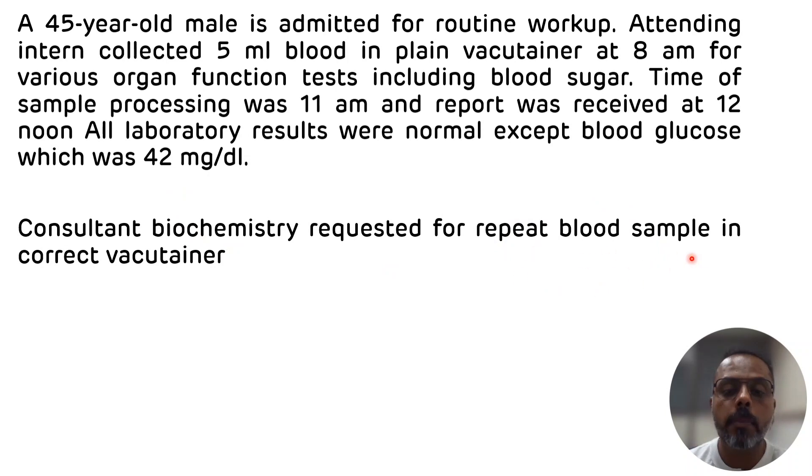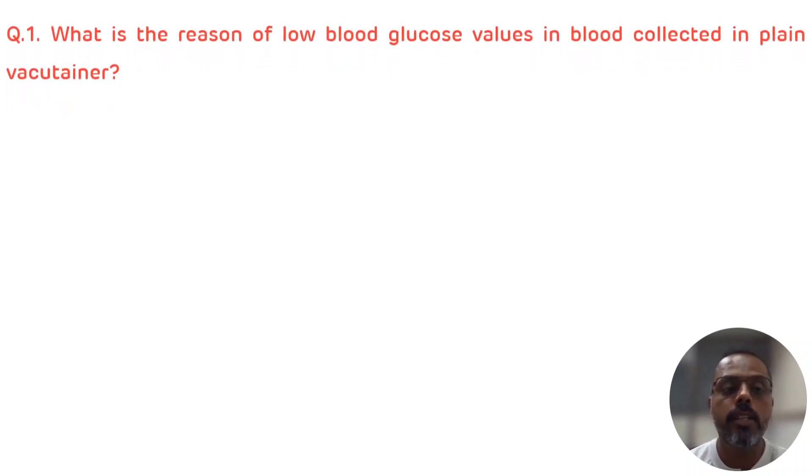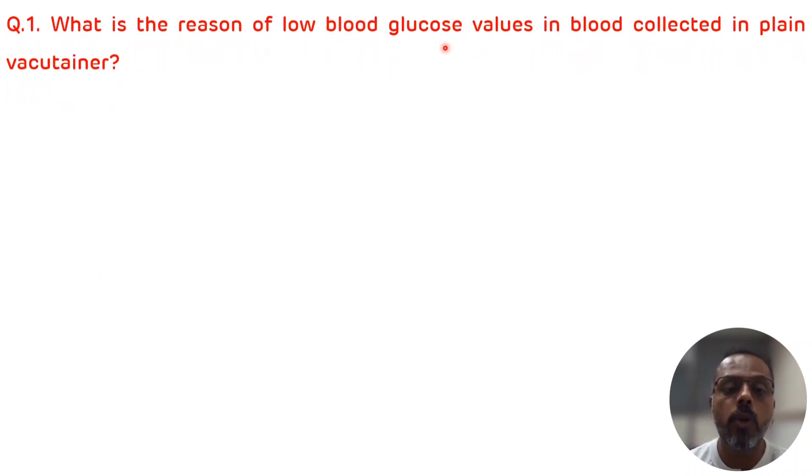The intern in biochemistry requested for repeat blood sample in correct vacutainer. Now let's see what are the questions. The first question is: what is the reason of low blood glucose value in blood collected in plain vacutainer?